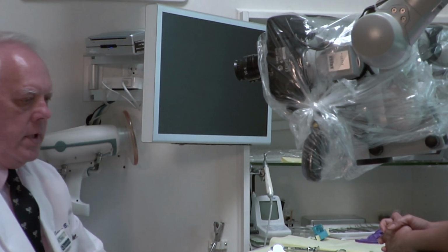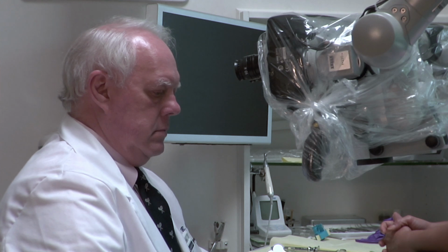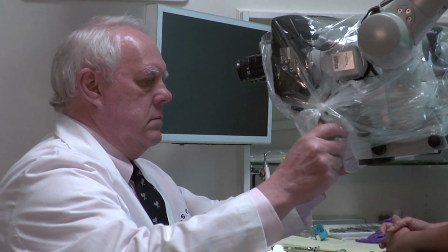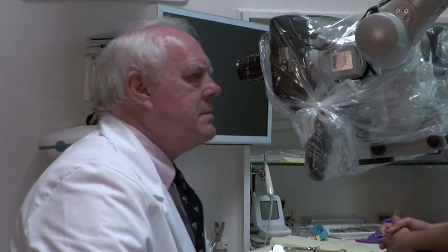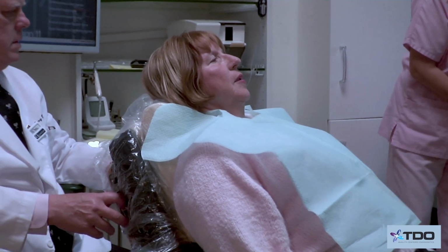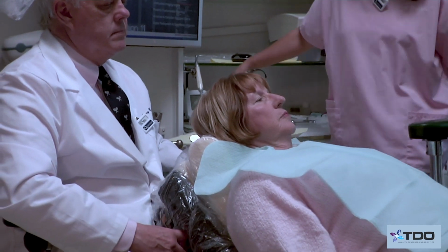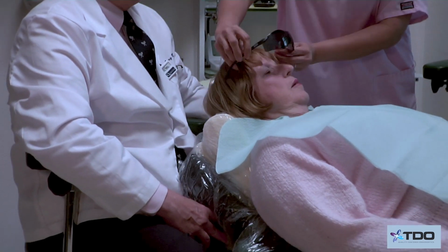So this is a video we made many years ago showing this. You might find it helpful if we show it again. In order to understand patient positioning, a brief description of chair ergonomics is in order. Many frustrations with microscope use can be traced to incorrect chair design.